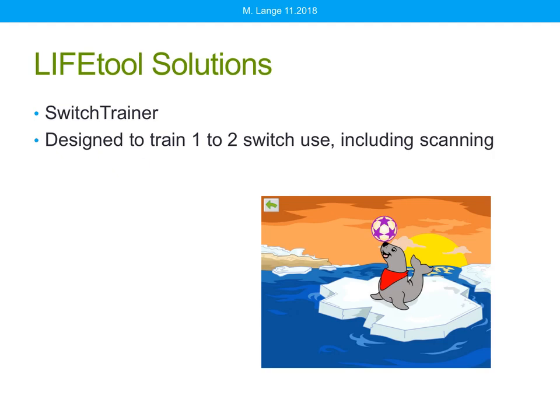There's another company called Life Tool Solutions. Now, I haven't used this app myself, but I found some information about it. They have a program called Switch Trainer, and it's designed to train either 1 or 2 switches, and it includes those scanning skills. So I haven't tried this one myself. If any of you have, please let me know.